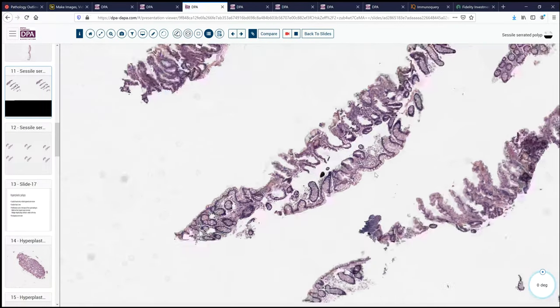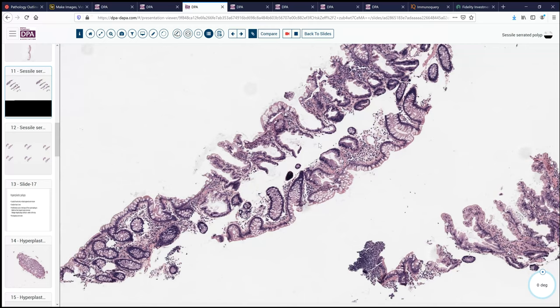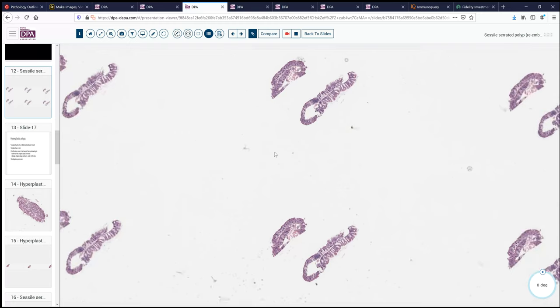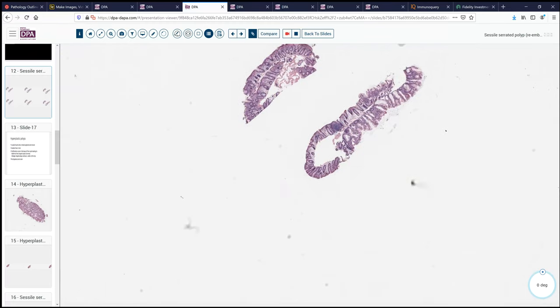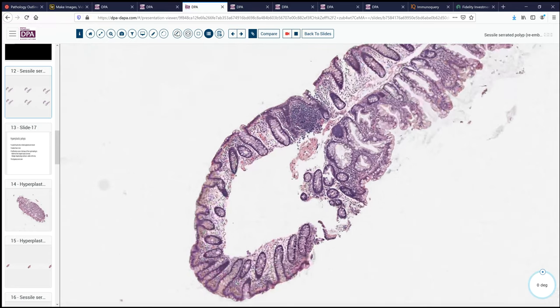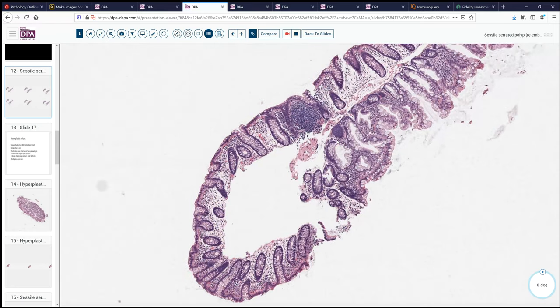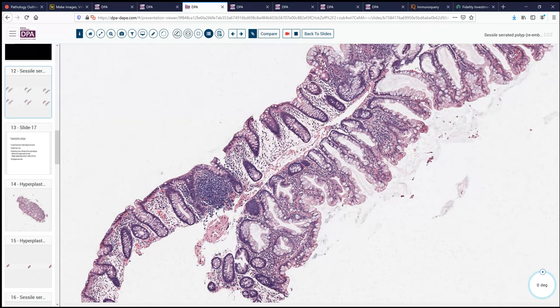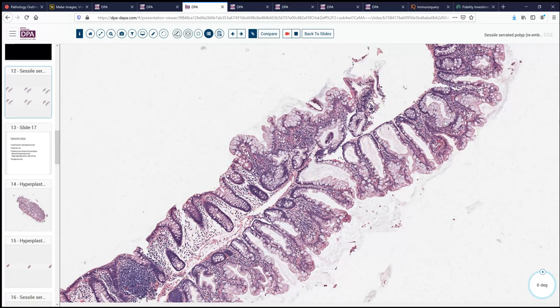Here we see more of this nice deep glandular dilatation characteristic of these lesions, and the branching in both directions. One final example: again we see a flat lesion with generally parallel glands, some deep dilatation, and serrated epithelial architecture. This is a sessile serrated adenoma or lesion.